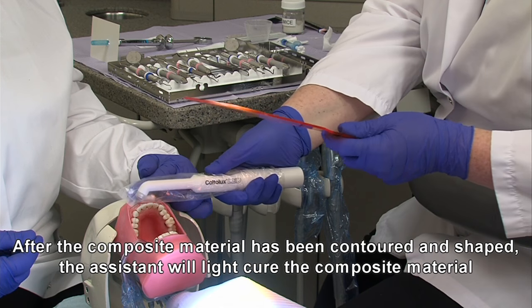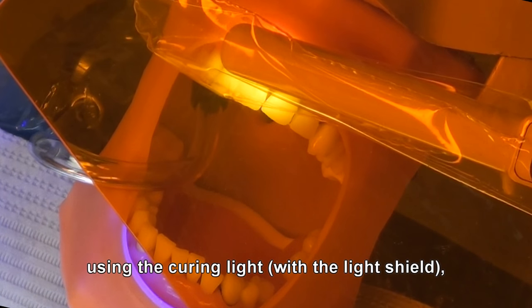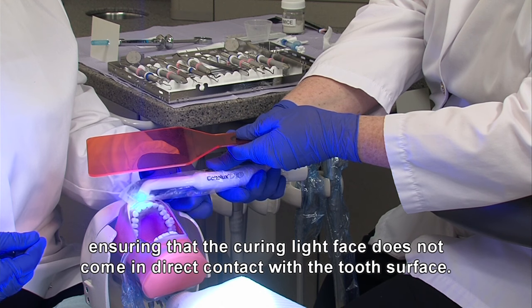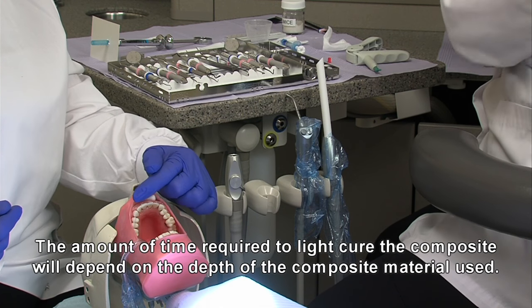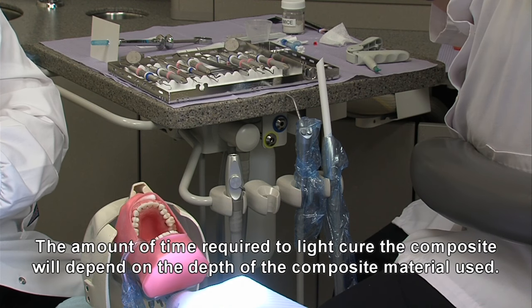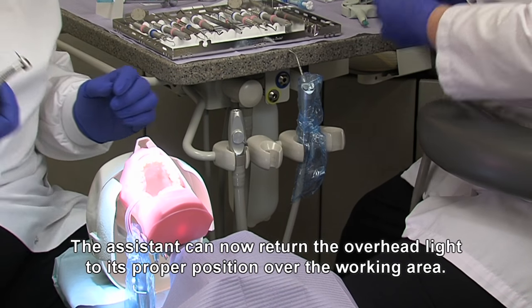After the composite material has been contoured and shaped, the assistant will light cure the composite material using the curing light and the light shield, ensuring that the curing light face does not come into direct contact with the tooth surface. The amount of time required to light cure the composite will depend on the depth of the composite material used. The assistant can now return the overhead light to its proper position over the working area.